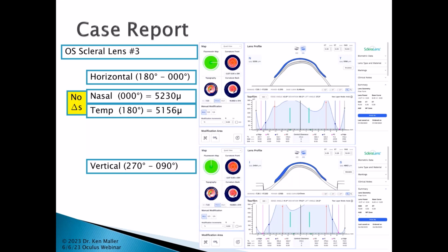Perfect. Let's see, the next question that I have for you. You mentioned making your patient comfortable, and I had a question or two about improving capture on dry eye patients. What do you recommend for those dry eye patients and things that are particularly successful in improving coverage for them? Well, one of the nice things, obviously, and I've spoken about it before with the Pentacam, is it's not tear film dependent. So even if they're miserable, it's not going to affect the data that you're getting. So from your side, that's a very good thing.